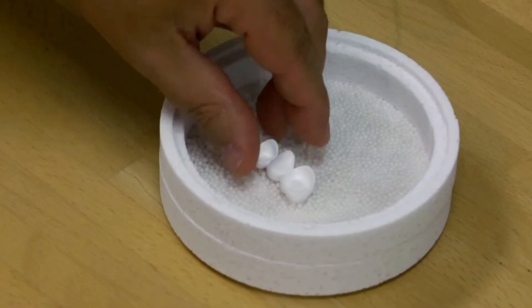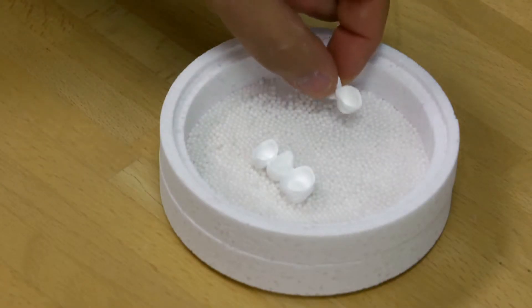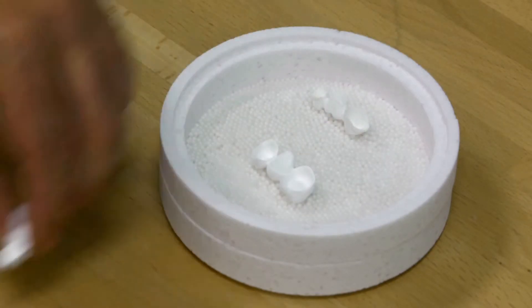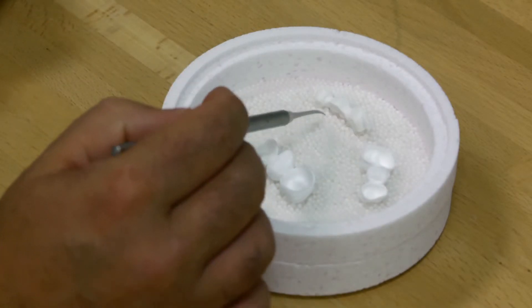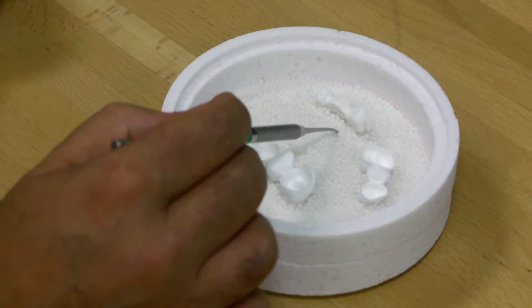Only use the sintering trays and beads intended for the respective high temperature furnaces when sintering Inchorus TZI. Make sure that the restorations are lying completely on the bed of beads. Remove beads lying interdentally with a probe so that shrinking is unhindered.